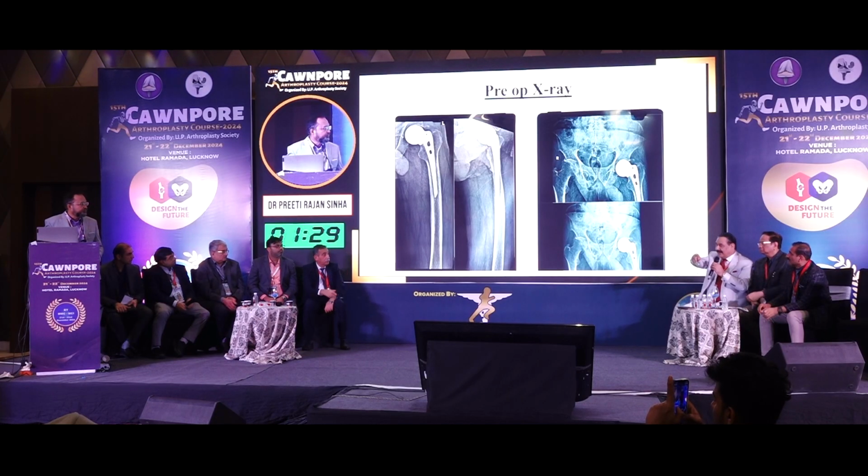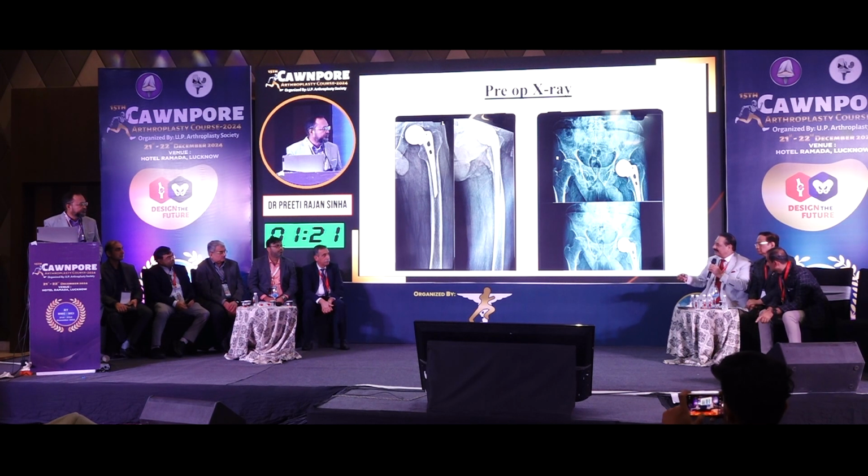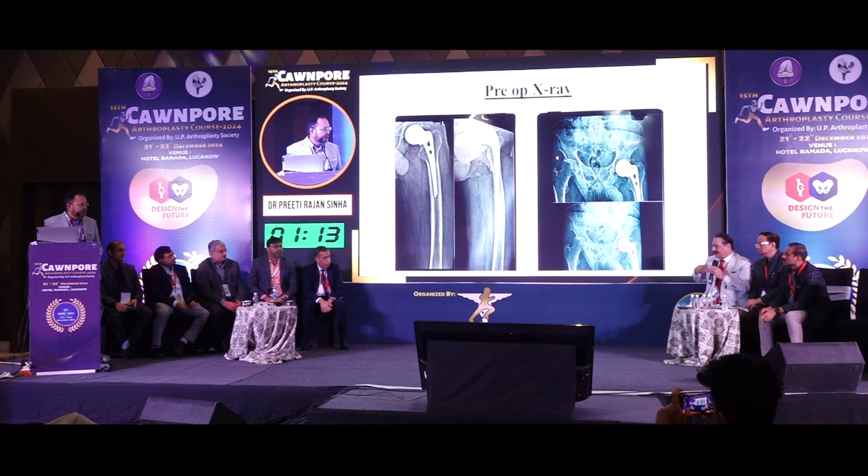No, that's why I asked for the case for discussion to show the slide, because that one case could have been done with cement in cement, but the author wanted to improve the acetabular position also. The acetabulum was vertical, so he thought, I'll improve the acetabular position also. Unless you have that in mind, we are talking of another case. He posed another question to me.